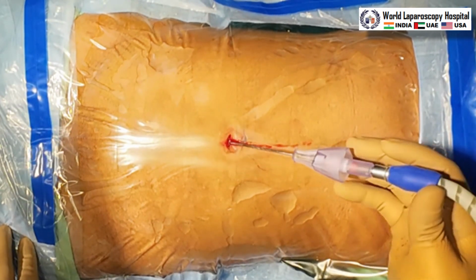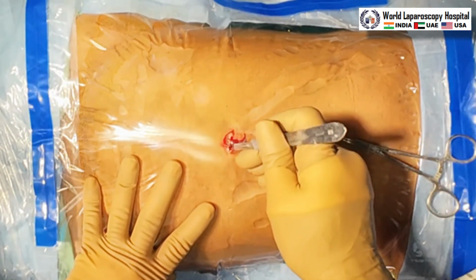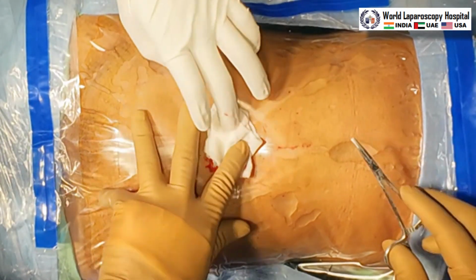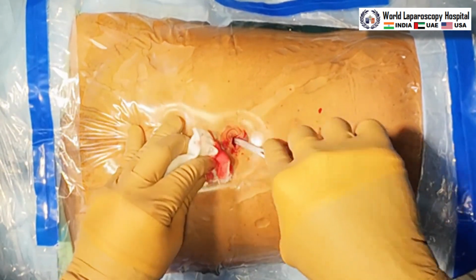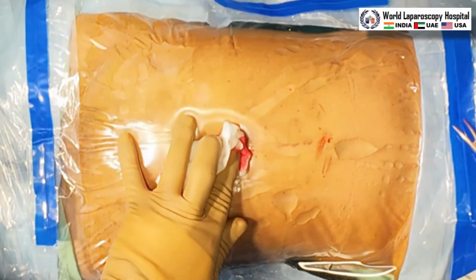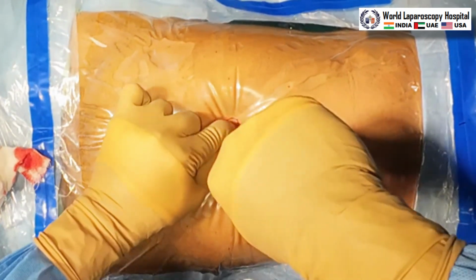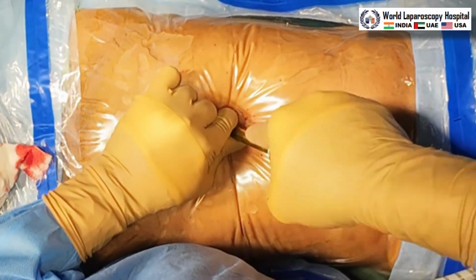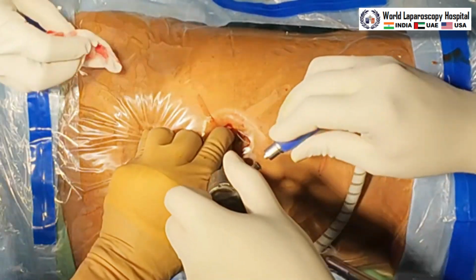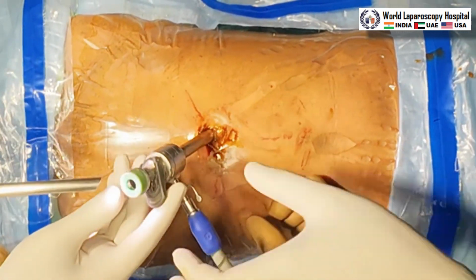Approximately 3 liters of gas is used to insufflate the abdomen, and after that we will enlarge this incision to 11 mm to introduce the first port. You can stretch up to the rectus with a mosquito forceps. And now this is the optical port, which will be introduced through the inferior crease of the umbilicus. So, it is in, a hissing sound will be heard, the trocar is introduced, the cannula is attached to the insufflator again and then we will put the optical port. Telescope is introduced.